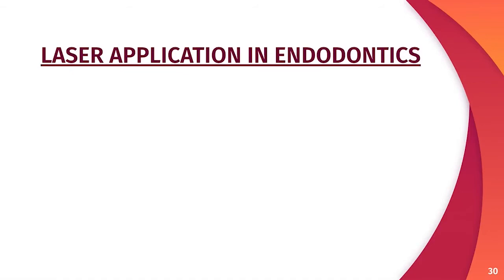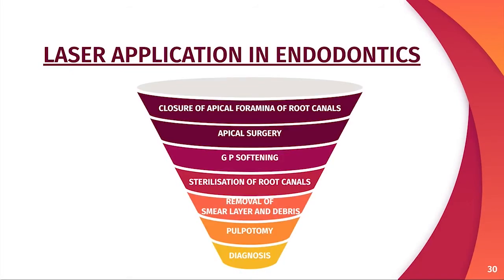Laser applications in endodontics include diagnosis, pulpotomy, removal of smear layer and debris, sterilization of root canal, GP softening, apical surgery, closure of apical foramina of root canals.